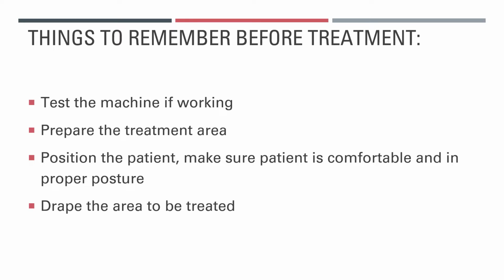Then prepare the treatment area. Prepare the necessary towels that will be used, the pillows, etc. And then position the patient. Now make sure the patient is comfortable and in proper posture and properly expose and drape the area to be treated.